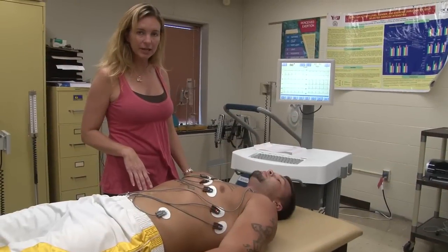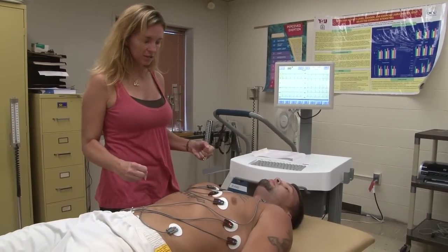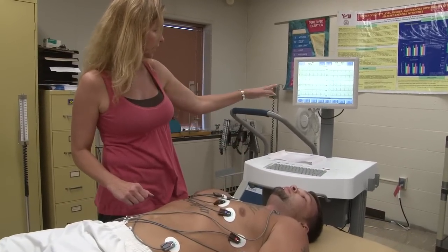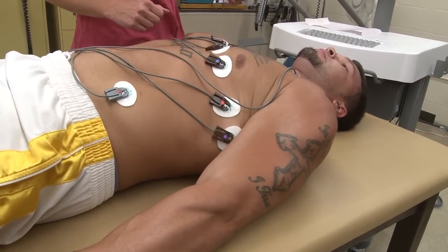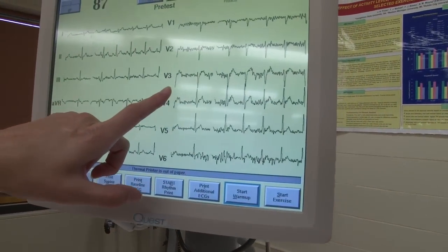All right, what we're going to demonstrate now is what happens when you have a patient that's really tense or really tightening up their muscles. I'm going to have Jake really squeeze all of his muscles right now, and we'll see what's going to happen on the screen. Right now you see a normal sinus rhythm. Everything looks good, but he's going to go ahead and tighten everything up, and you can see how much artifact we have.